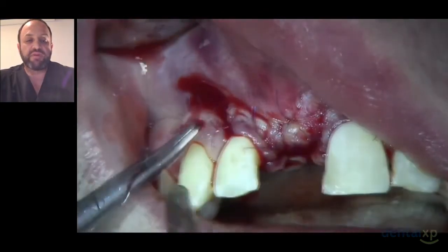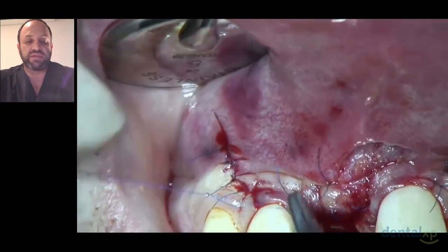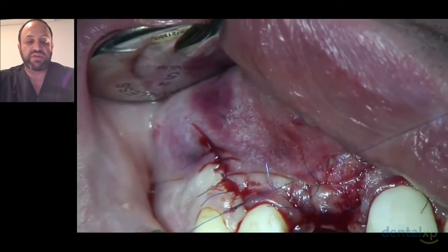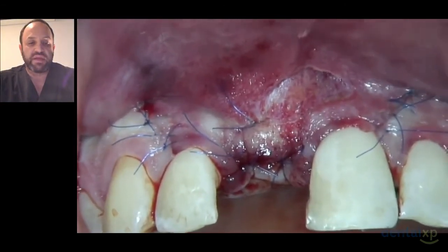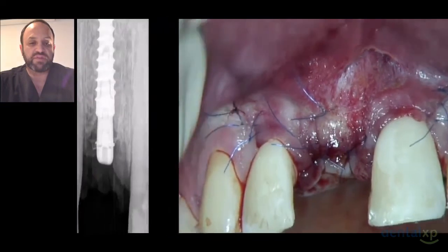I'm going away from the top first, and I pull on there, and my last suture is the top one to get that last little bit nicely positioned so that everything's placed well. I don't allow anything to grow into the area on its own. And here you can see very, very nicely closed up, everything in position.